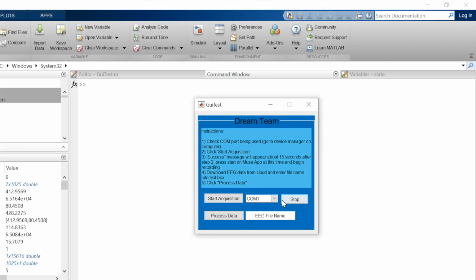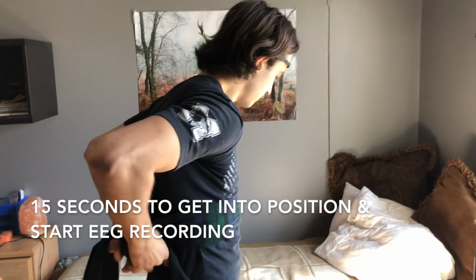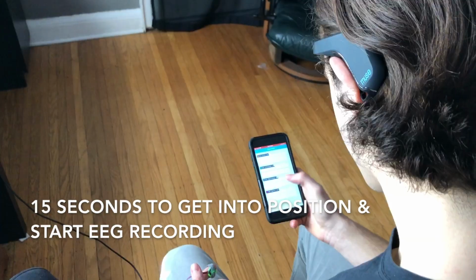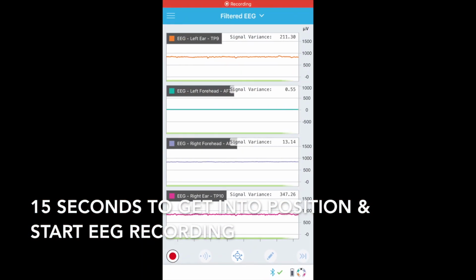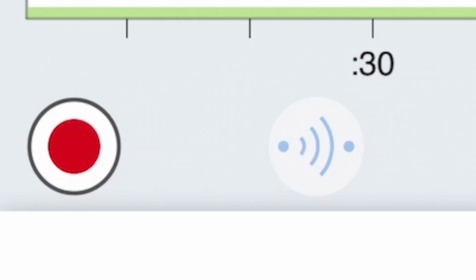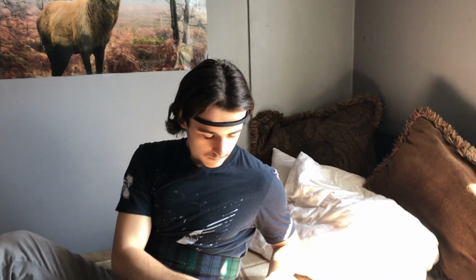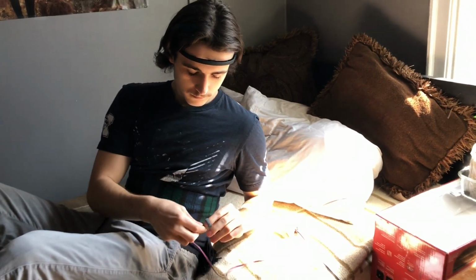Right now we're looking at the GUI, which the user interfaces with in order to start signal acquisition and begin signal processing. First, the user will choose an appropriate COM port that is being used for serial communication. Once the user then clicks Start Acquisition, they will have 15 seconds to get into position and start recording their EEG. Recording the EEG is as easy as opening the Muse Direct app and clicking Begin Recording. This file is then automatically uploaded to their proprietary cloud service where it can be downloaded and accessed in the processing steps.